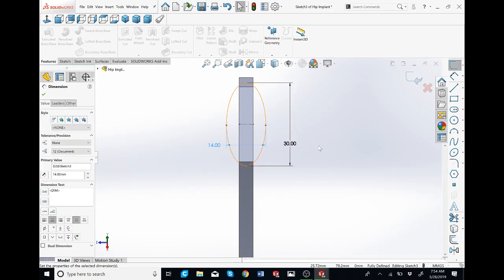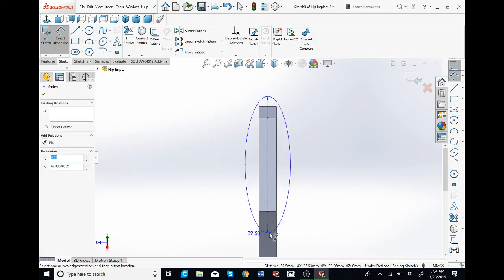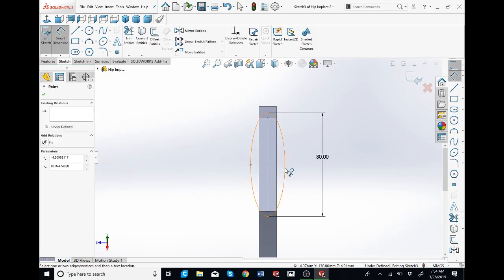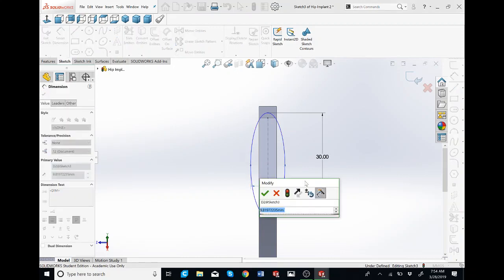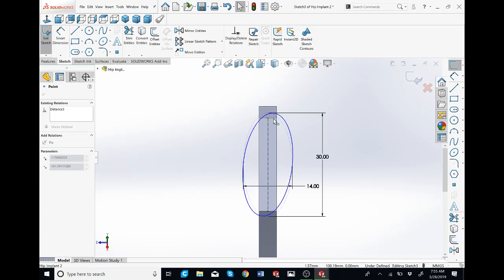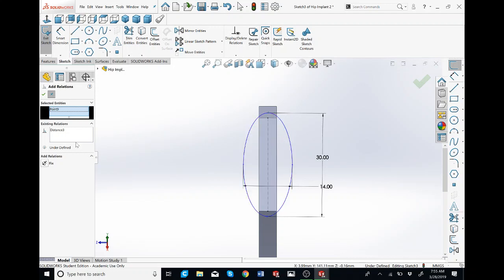So 30 and 14. I'm going to go to my smart dimension tool. I'm going to click on the bottom point, make this 30, and then click that point and this point, and make this 14. Make sure I got my dimensions right. Yep. So you see it's still blue, showing that it's undefined because I could rotate it. So instead I'm going to make a relation, add relation. My point's already pre-selected, so it does it for me. And I'm going to click the middle point here and just make it vertical. So now it's fully defined.